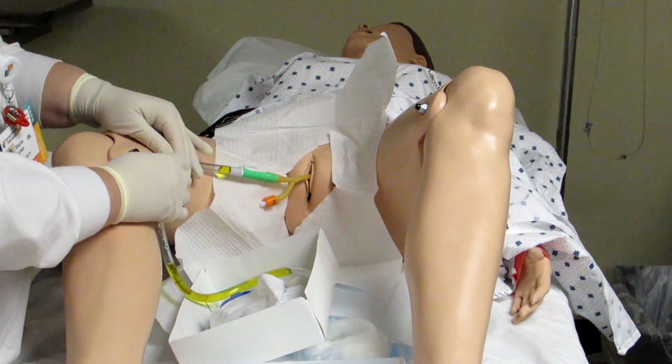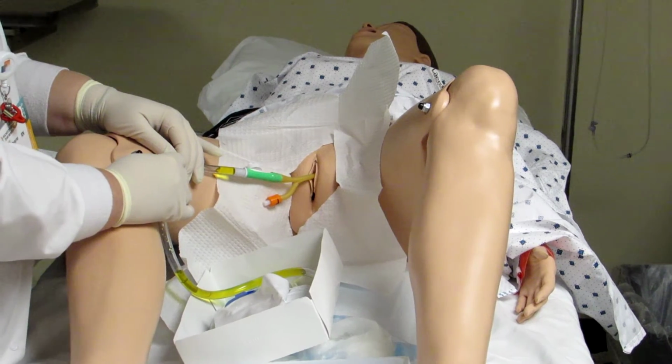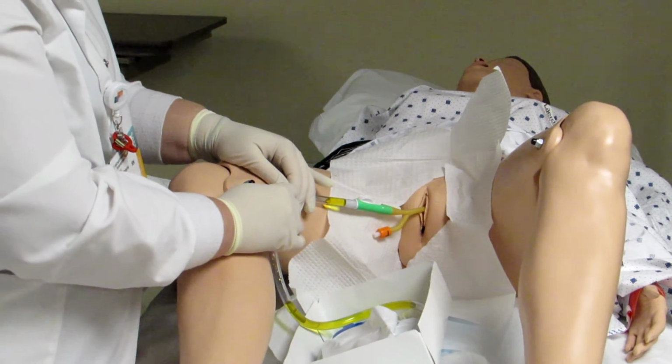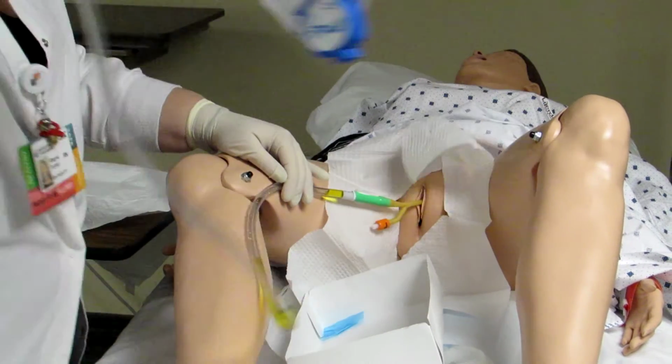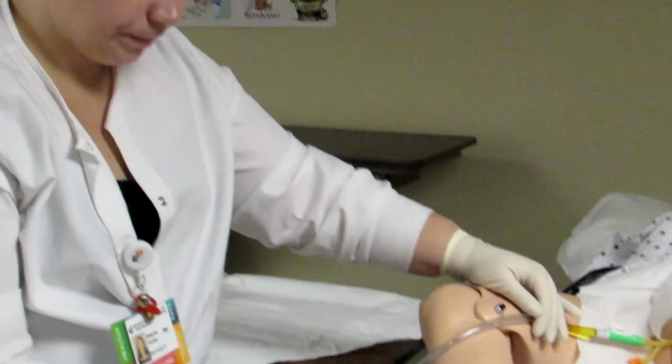I'm going to secure this to the leg of my patient, either via tape or a nice leg strap that you can find on the unit. And I'm going to take this out and hang it on the side of the bed.